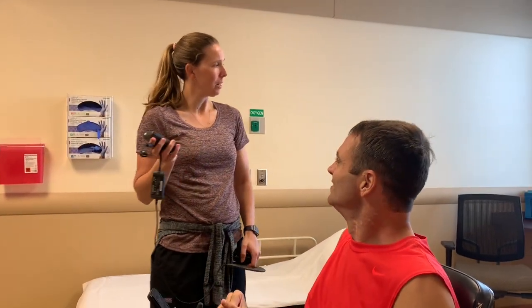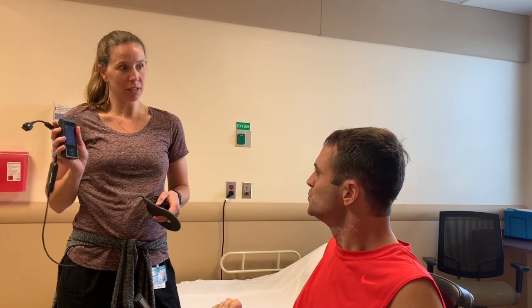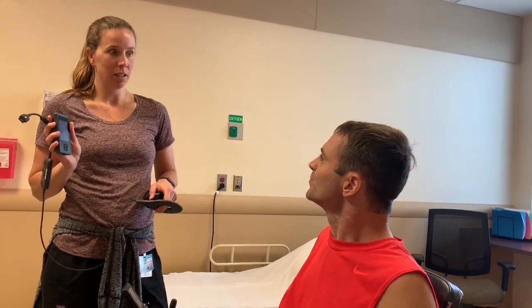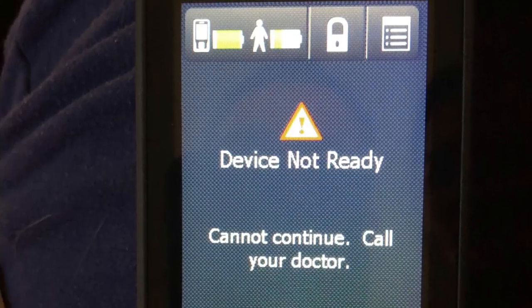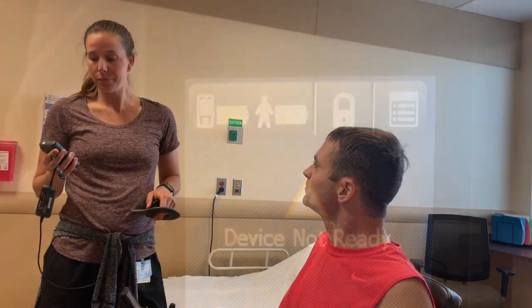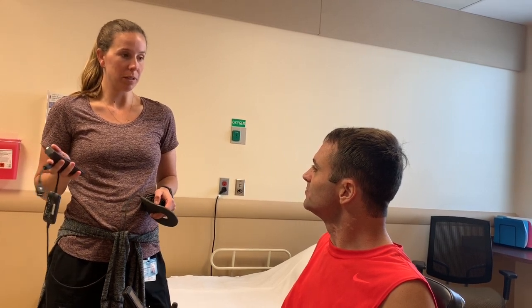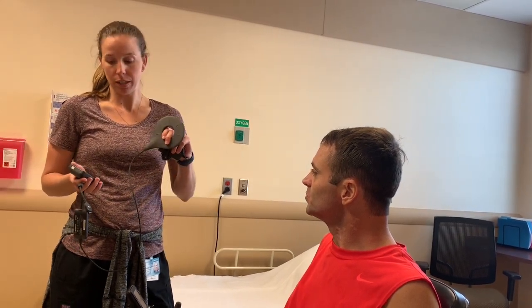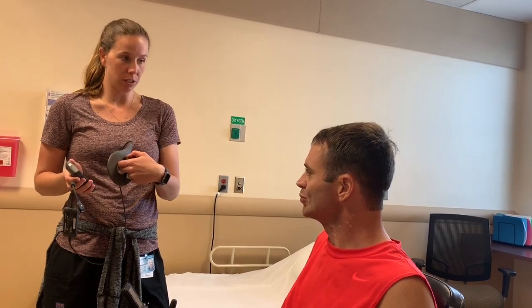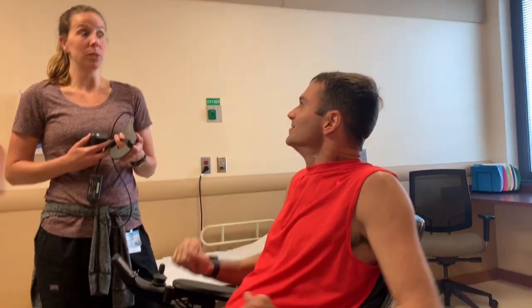It might give you some kind of error whenever you get all the way through, just because there are no programs in here yet, and that's all that means. It should show that it's charging and when it's fully charged. And just make sure you are fully charged.